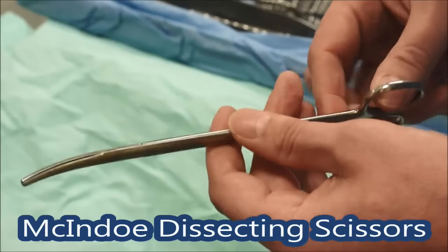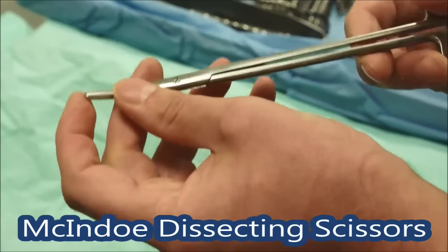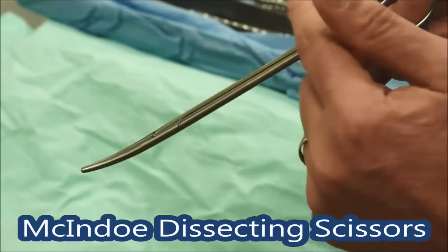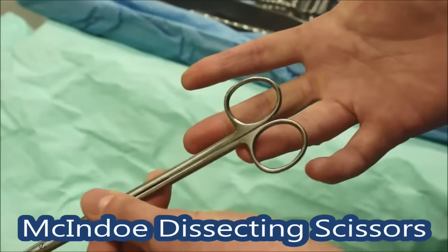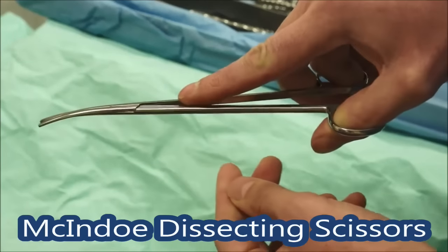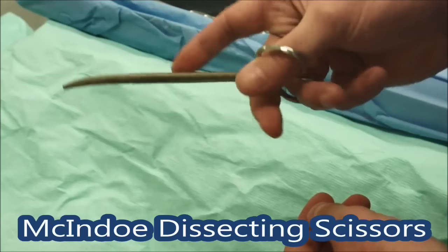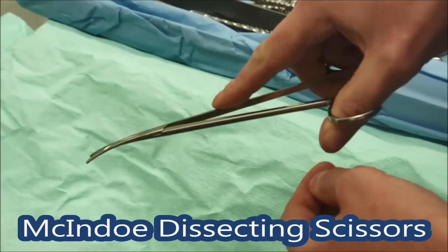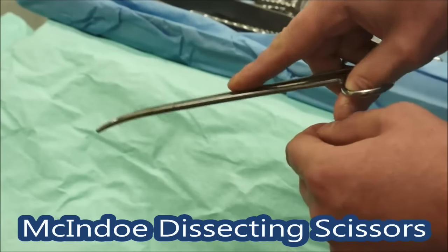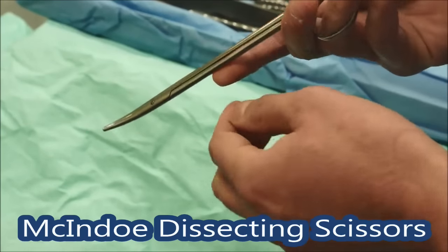These are the McIndoe scissors — really the workhorse of your dissection if you're not using diathermy. They're gently curved towards the tip and have a round tip so you can't stick it too hard into anything, which is a safety measure. When holding all these instruments, put your ring finger through that hole, your thumb through there, and your index finger near the pivot — that stabilises it. You can use them to dissect with, and when cutting just use the very tips. Don't cut sutures with these — they're tissue dissecting scissors and it will blunt them, making the scrub nurse very upset.